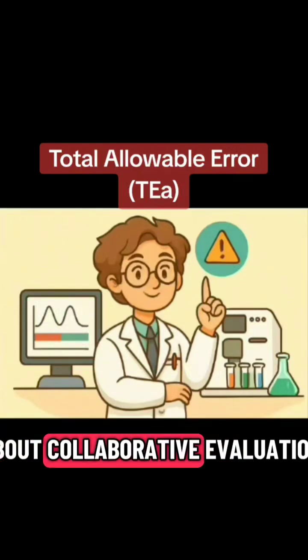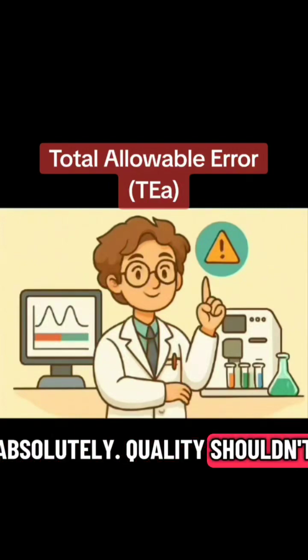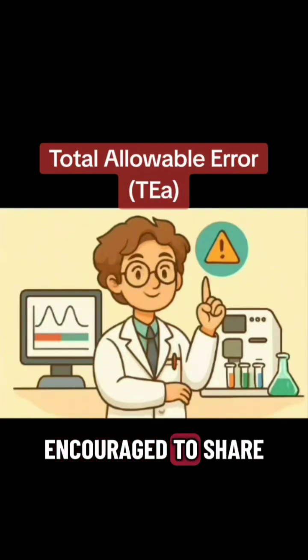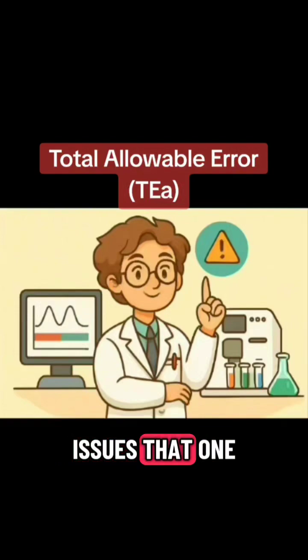And there was also a point about collaborative evaluation, which seems especially important for, say, a large hospital network. Absolutely. Quality shouldn't be a solo effort. Labs are really encouraged to share their verification findings with their team, with other labs in their network. It helps spread best practices and can help you spot systemic issues that one person might miss.